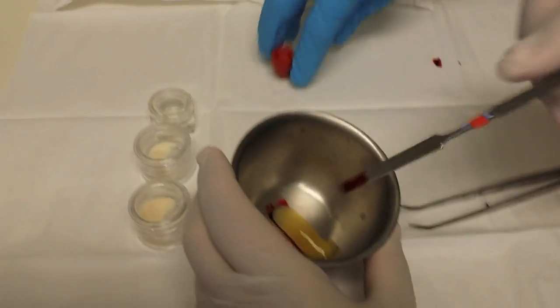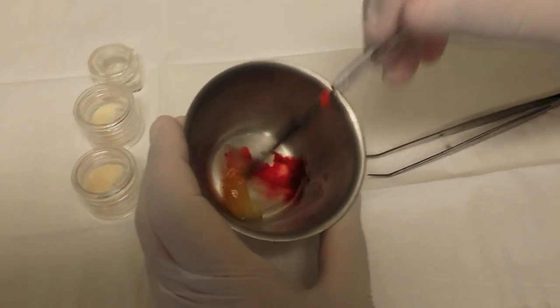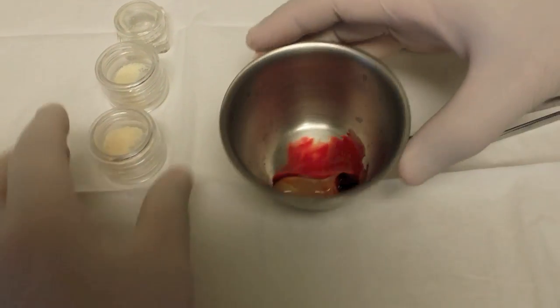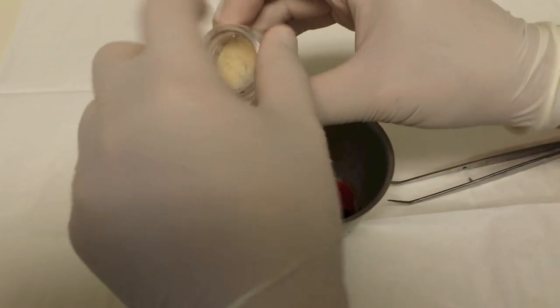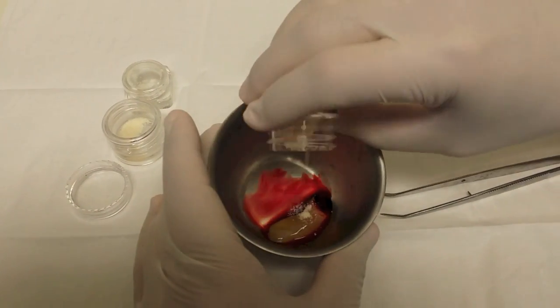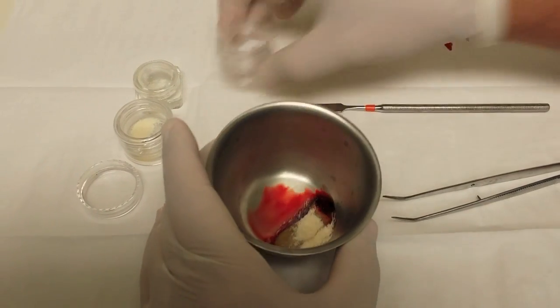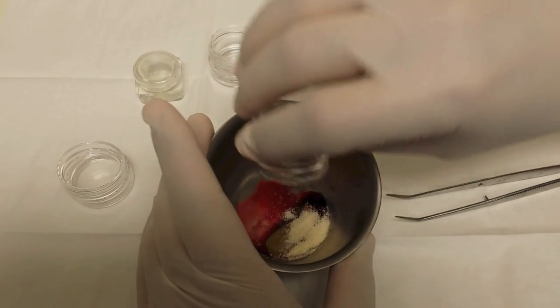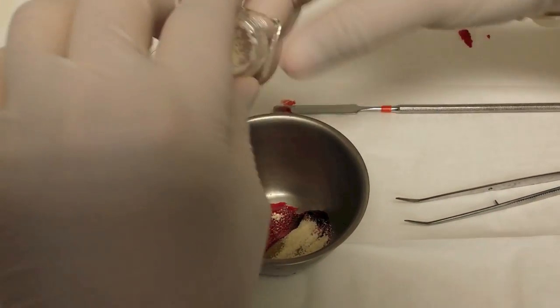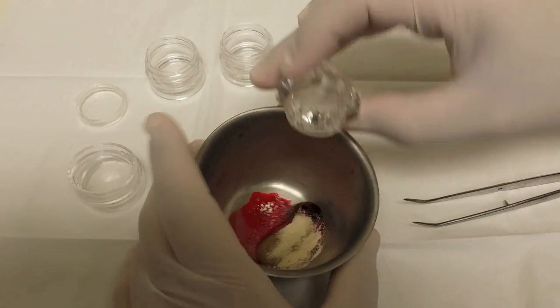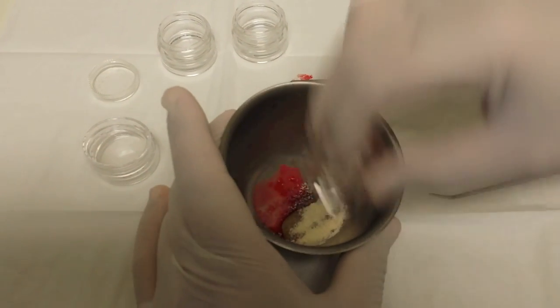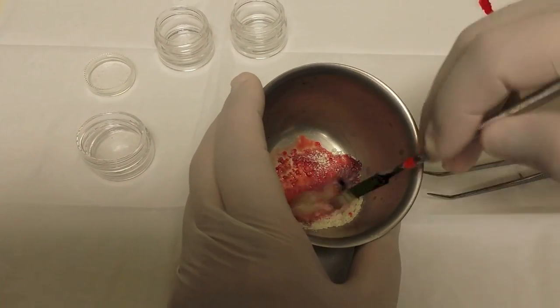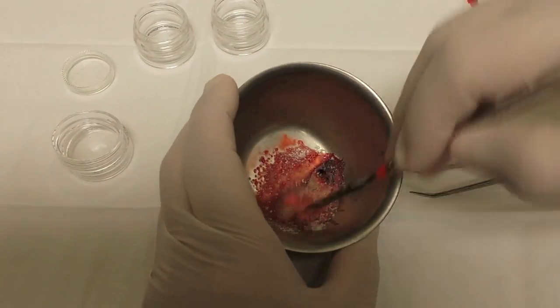So now you can see the snot clot. You can see why they call it snot clot, right? So then these obviously are some sterile vials of bone. We're just going to go ahead and mix right in there and make like a little paste and have the bone be soaking ahead of time.